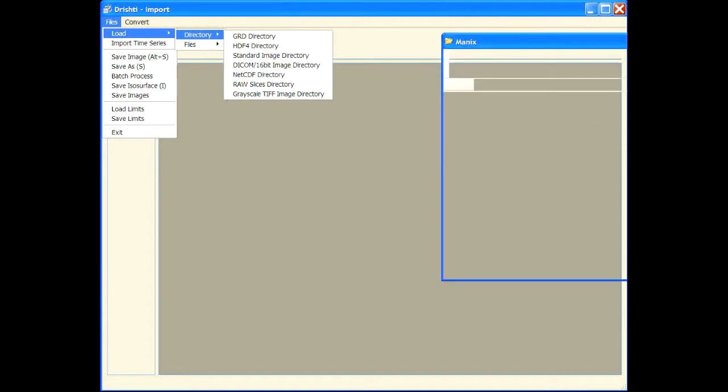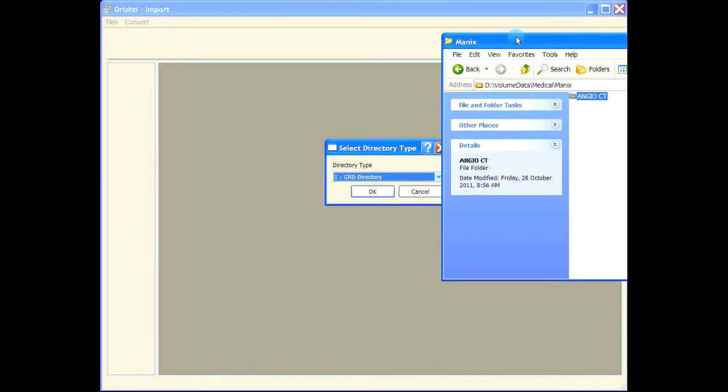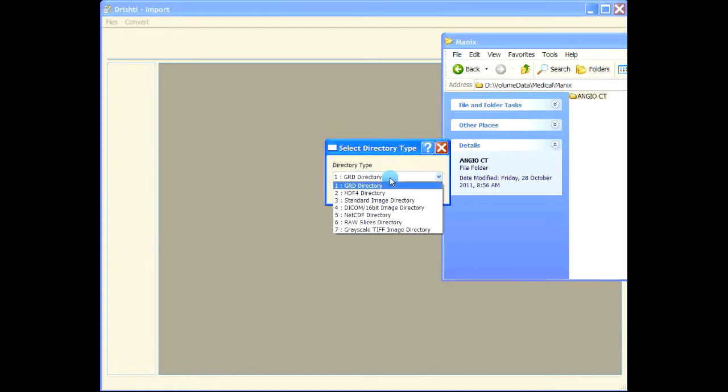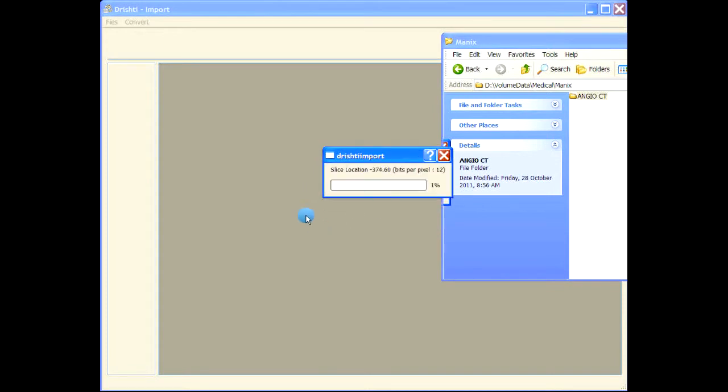Let's just drag and drop this directory here. It asks for the directory type - this is DICOM, so let's press OK. Now with the DICOM files, what it does is it goes and reads each file.